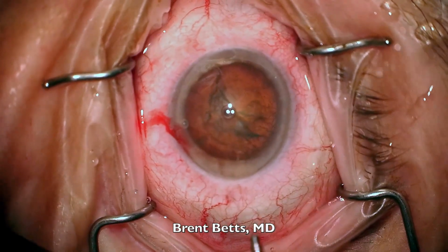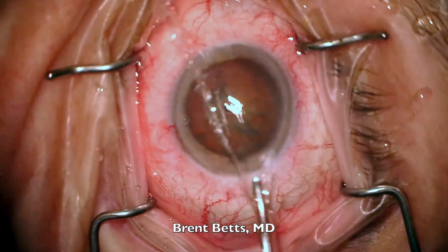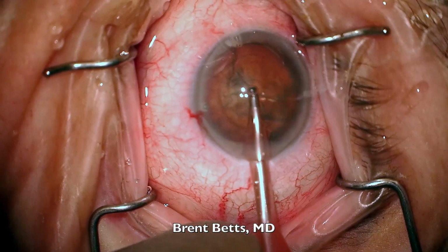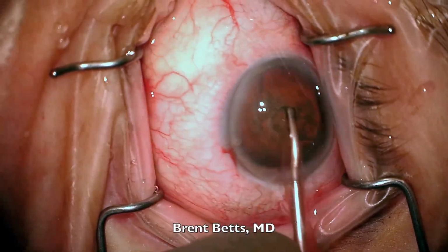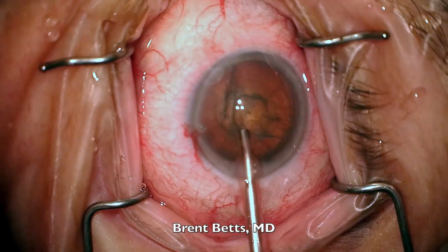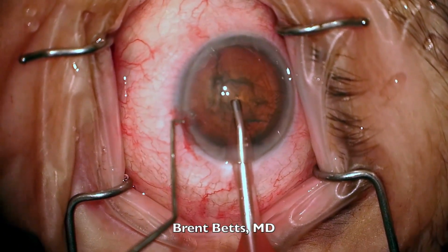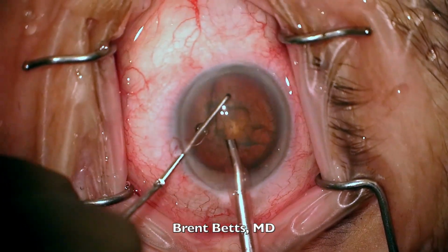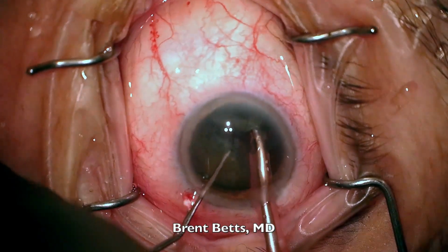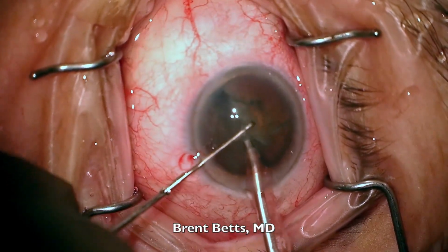The main tool that we use is called a phacoemulsification probe. It uses ultrasound to help us break up the cataract and remove it from the eye. I'm going to remove epinucleus and some viscoelastic material. Epinucleus is the outer layers of the cataract. And then using a second instrument, I'm going to use a technique called a double chop technique, where I bring the instruments together, splitting the cataract in half.